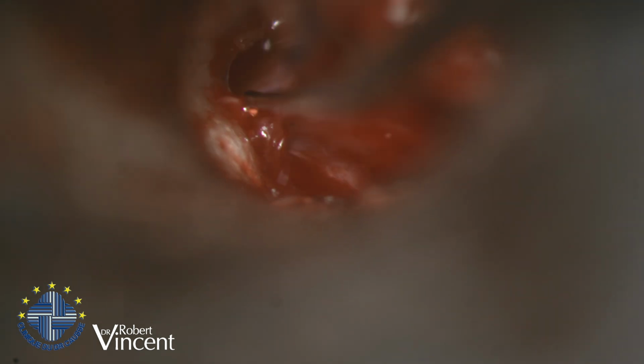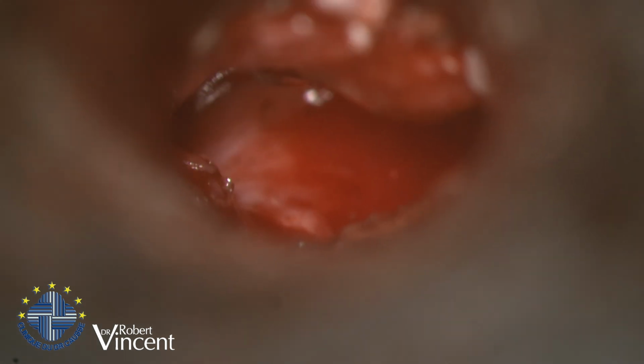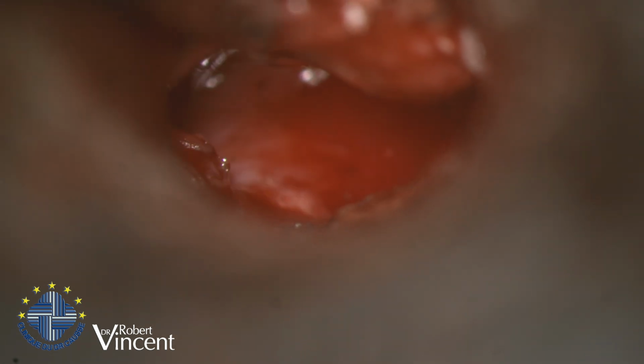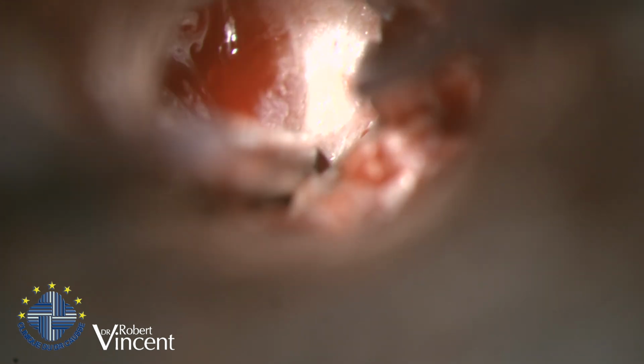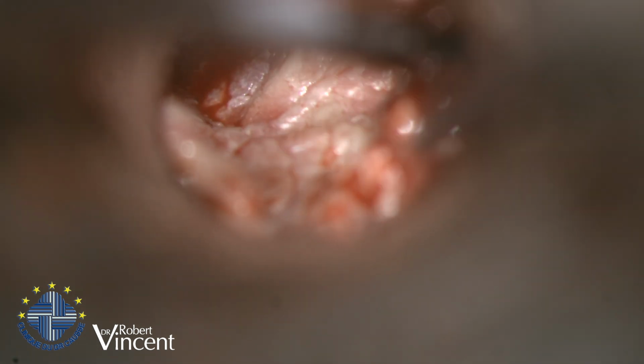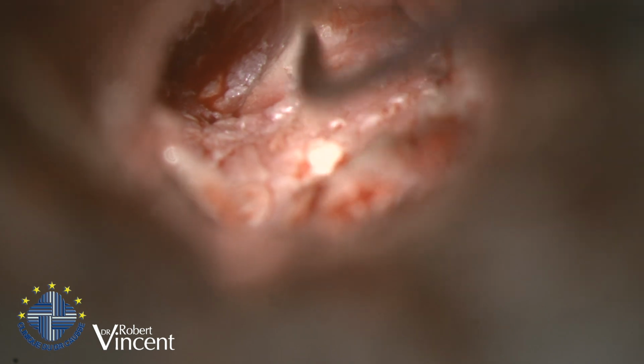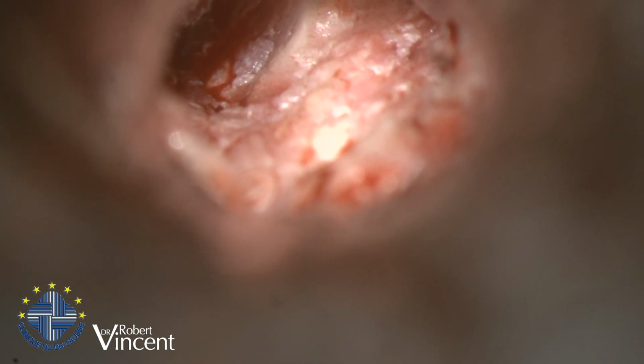So I will place it here. First I need to take a piece of cartilage. So I will reposition the flap temporarily in order to go back to the tragus. Because I took only the perichondrium, and that's not enough with a titanium prosthesis, especially with this atrophic area. I thought we could find some cartilage, but it seems that the previous surgeon was using several parts of cartilage placed together, but it's not working well. So I need to reinforce this area with both cartilage and perichondrium.